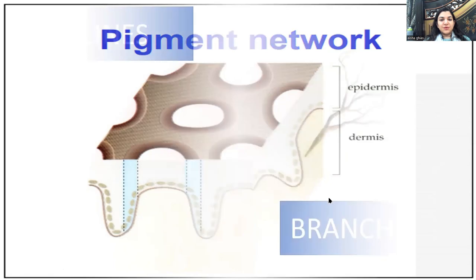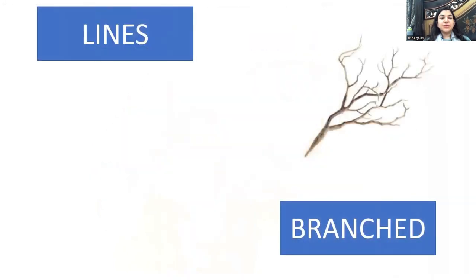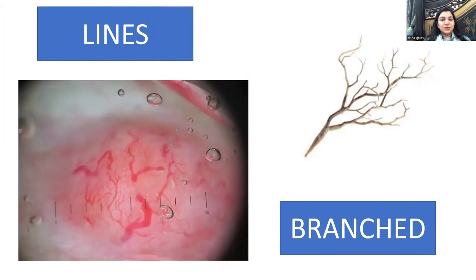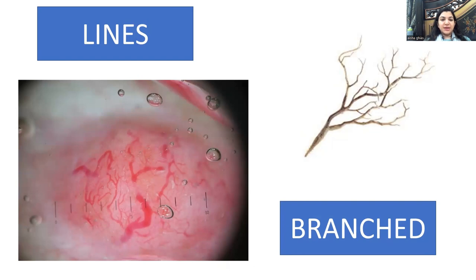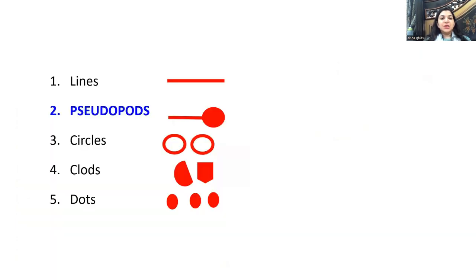The last line configuration is branched — seen in basal cell carcinoma. You can see thin and thick lines, which are blood vessels, forming branched lines. Pigmented branched lines also exist, but the example here is BCC with branched lines formed by blood vessels.